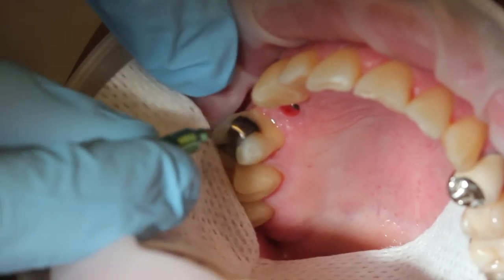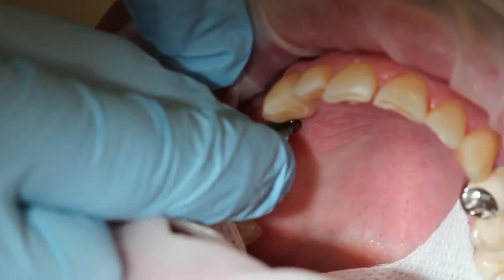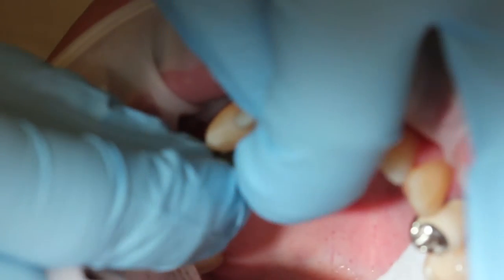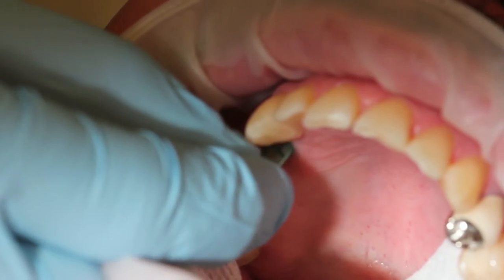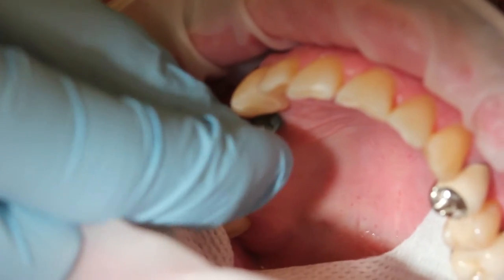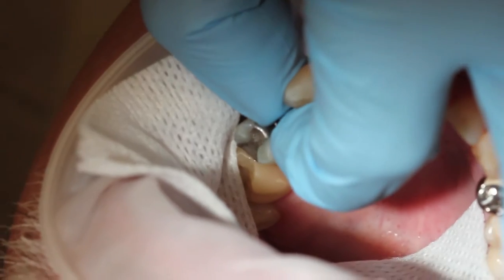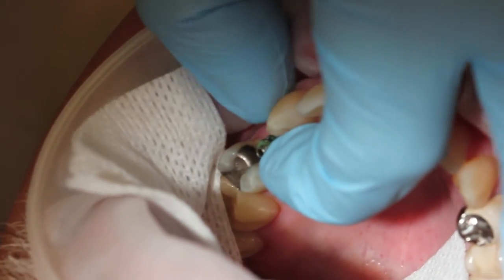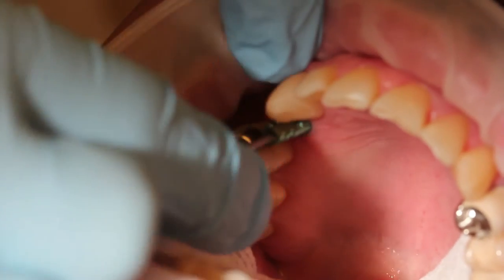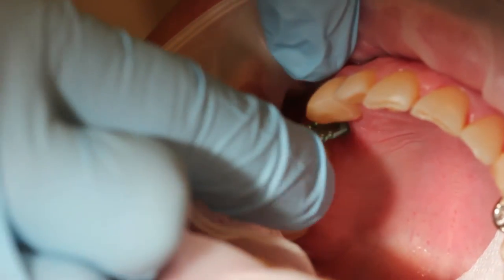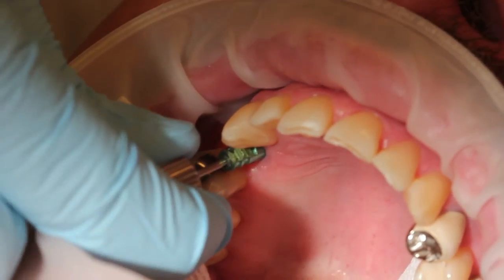The next step is to seat the impression coping. The impression coping has a hex at the bottom which will engage with the internal part of the implant. Once you think you have it seated fully, gently rotate the impression coping to make sure that the hexes are engaged. The anti-rotation component will tell you if it's seated all the way. Now tighten the implant with the driver and give it a good tighten to make sure that it's seated.